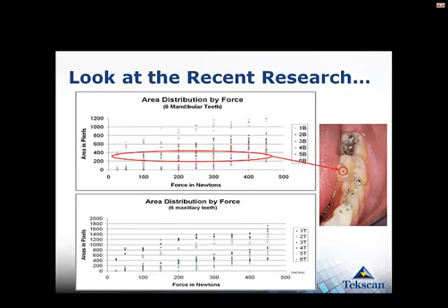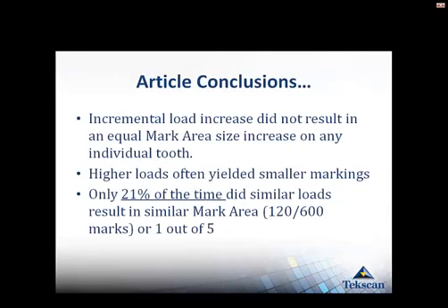The same as you could take this paper mark and this paper mark and say they were both 300 newtons. One might be 25 pixels and one might be 1,000 pixels. So looking at articulating paper marks is frustrating in your practice.